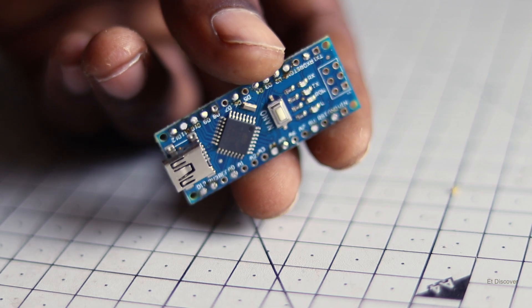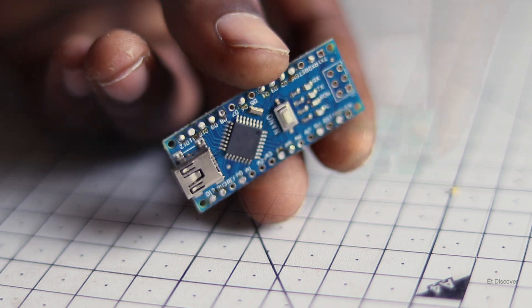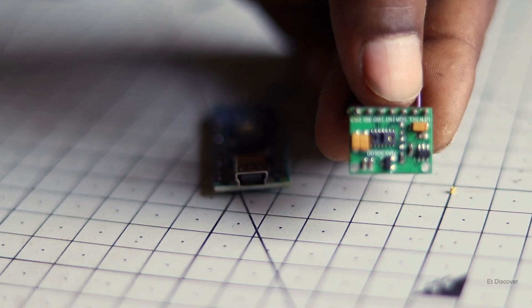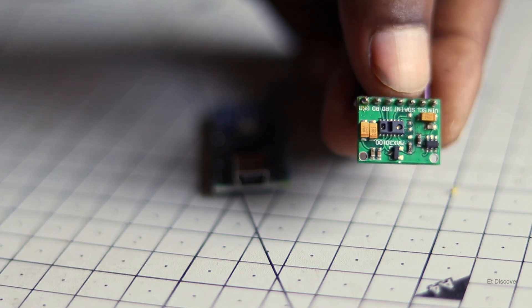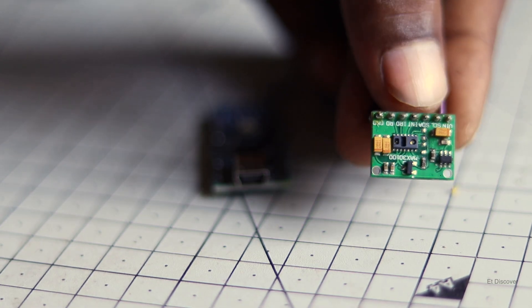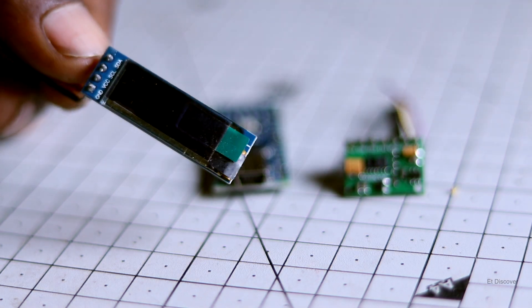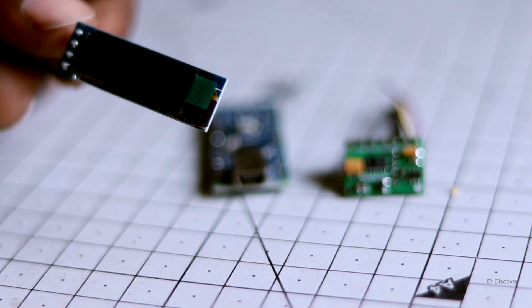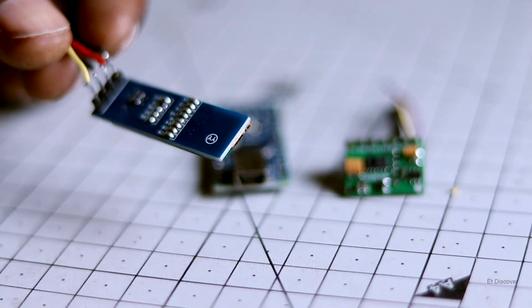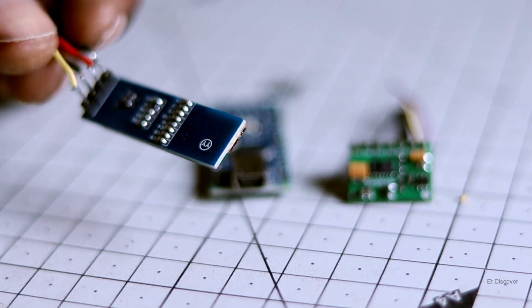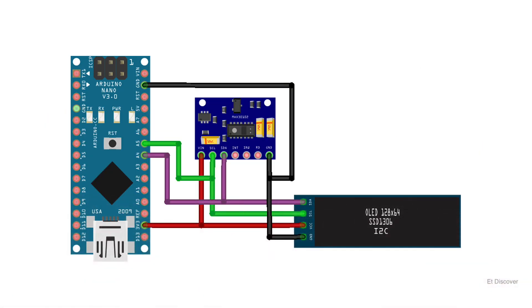To make this device, you need an Arduino Nano. Next a MAX30100 heart rate sensor module. And definitely for monitoring, we need an OLED display. And next according to this diagram, we need to connect everything.